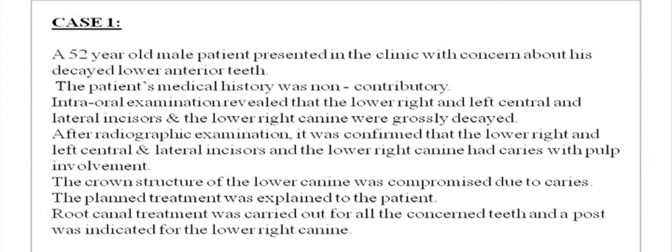Demonstration on patients. Case 1. A 52-year-old male patient presented in the clinic with concern about his decayed lower anterior teeth. The patient's medical history was non-contributory.